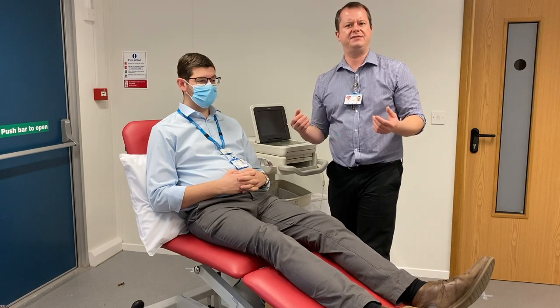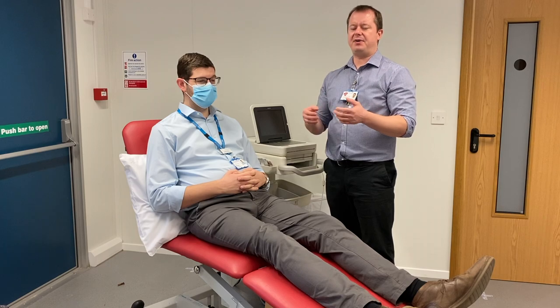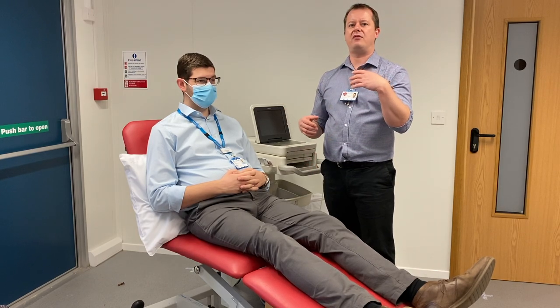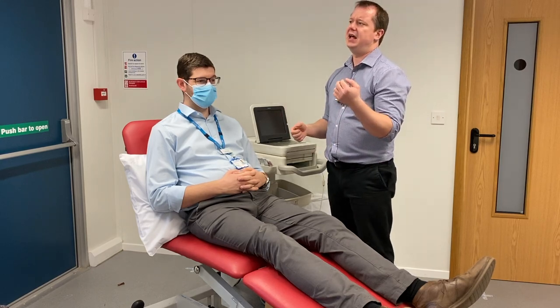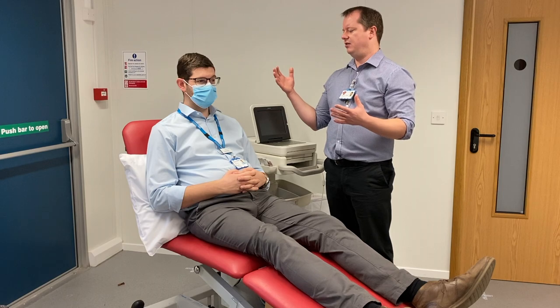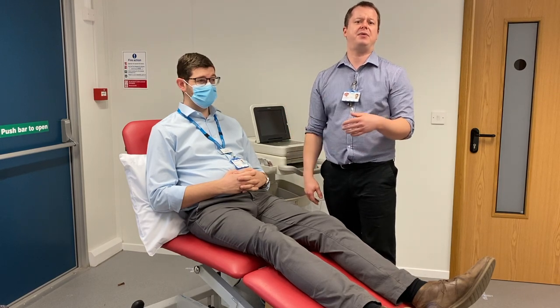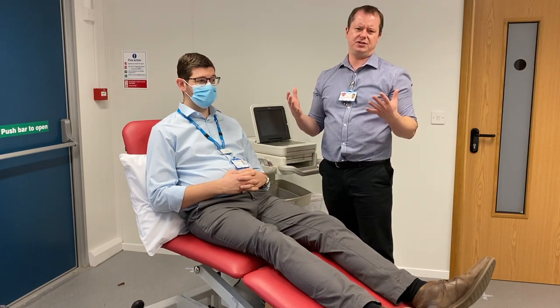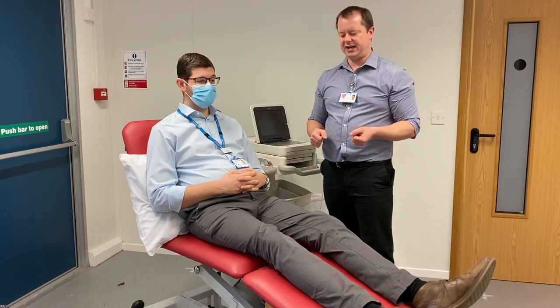We are looking at the electrical activity of the heart muscle, so we can use this test as part of our full assessment of the patient. We can do it for patients coming to the GP practice, for patients who are critically unwell, or as a pre-assessment for a patient who might be having a surgical procedure. There are multiple reasons to do this test, because it is a relatively simple, non-invasive test.